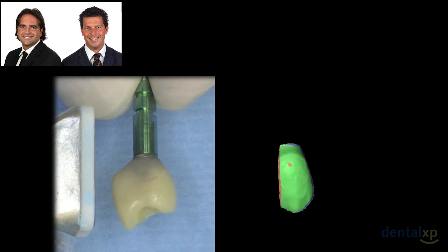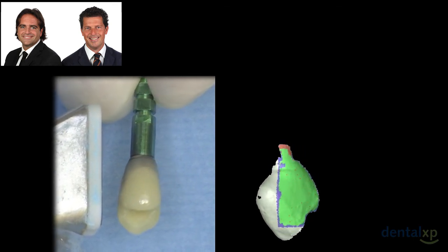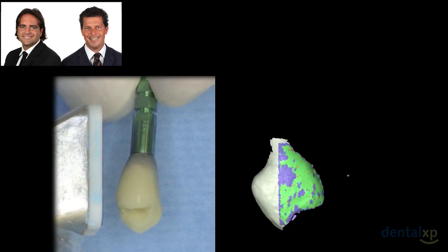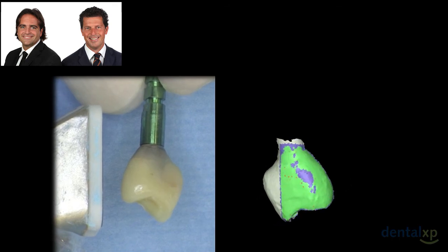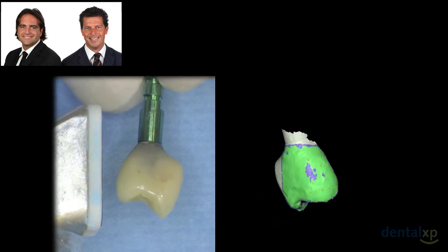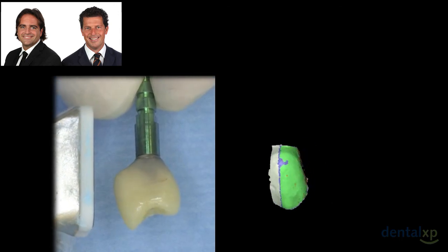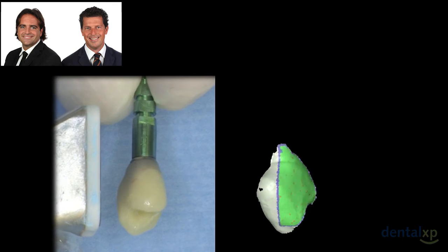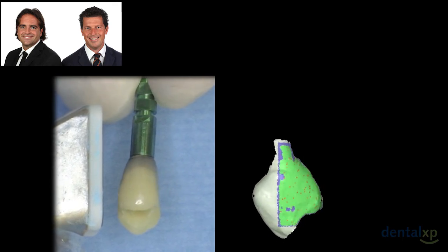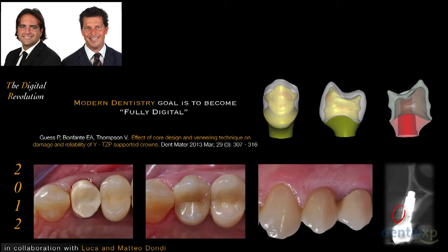So with the intraoral scanner, it's easy to take out the provisional restoration. We don't mind if the tissue is shrinking in the patient's mouth, because we know that here we are being precise. And it takes really 1 minute. And you can see here clinically and what is appearing on our computer screen. It's very easy. And of course, the workflow goes on.